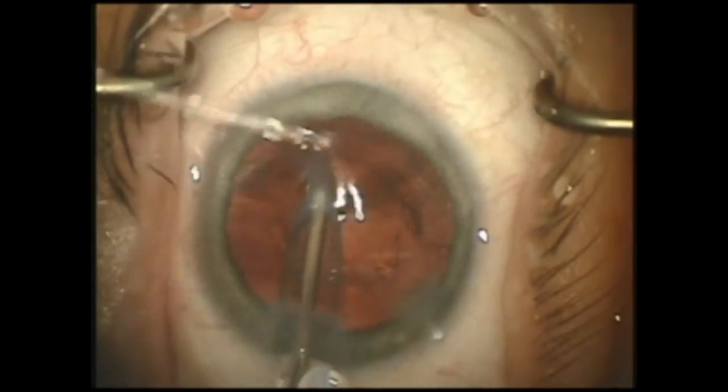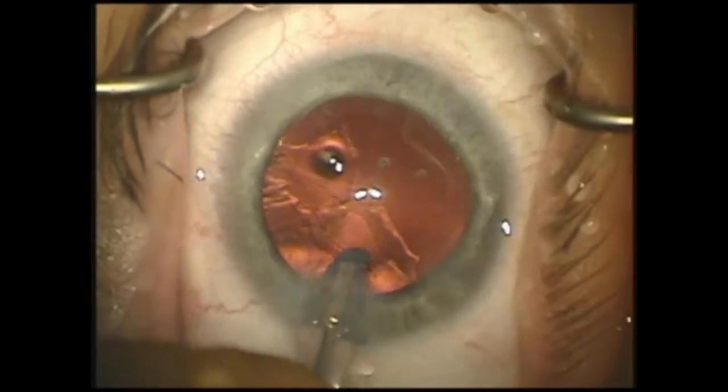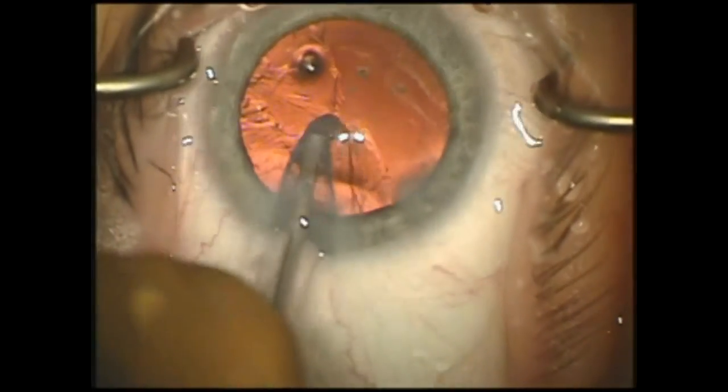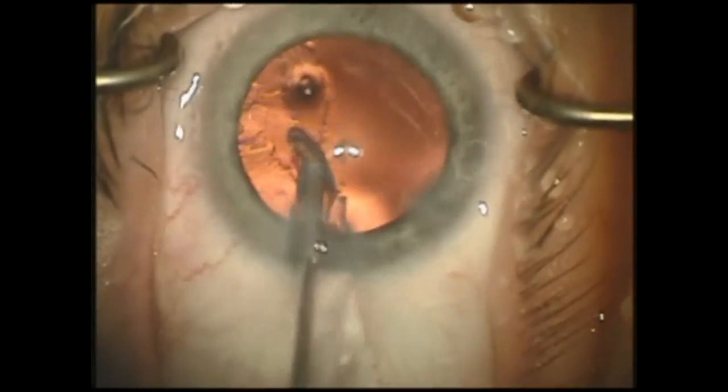I prefer to use a soft silicone irrigation and aspiration handpiece. The device that you see here in the video is called CapsuleGuard, it's produced by Bausch & Lomb. However, there are many different I&A handpieces available on the market today.